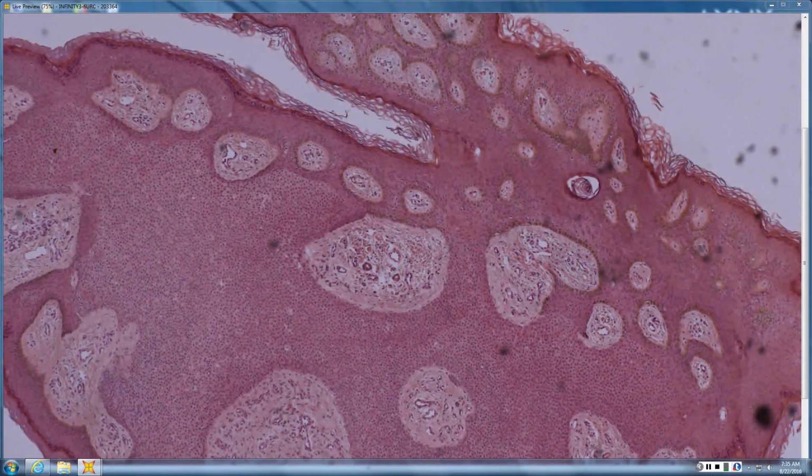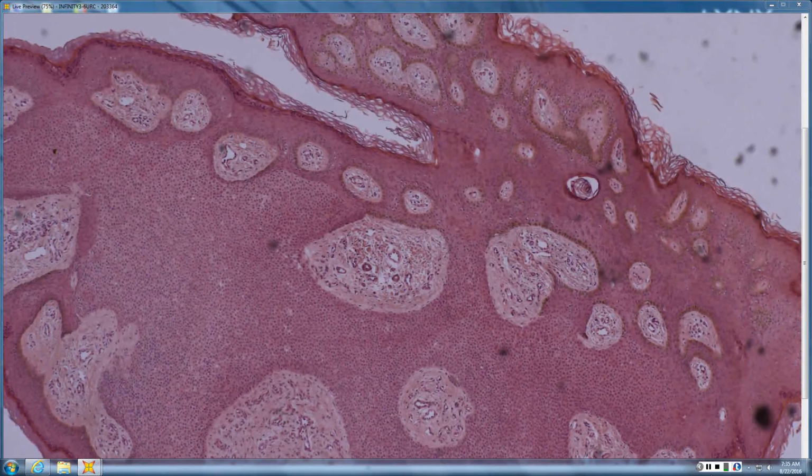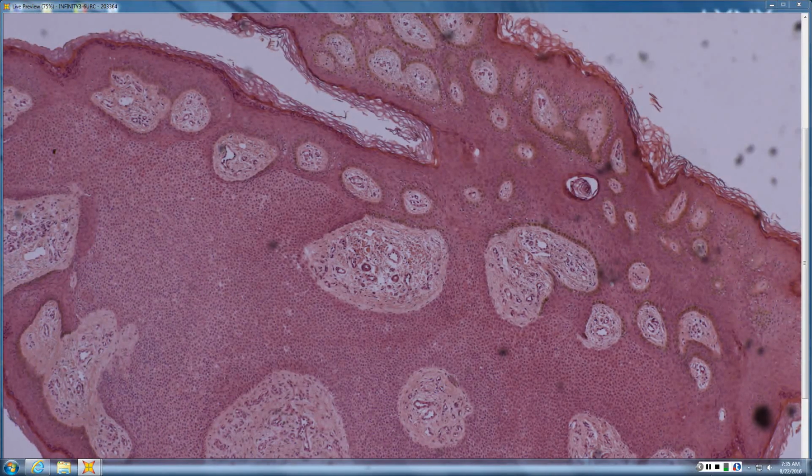The cells of an acrospiroma have ample cytoplasm, so they are pink tumors, whereas a lot of the others are just nuclei only. The ones that differentiate towards secretory coil are blue tumors. So this is one of the red tumors because it has cytoplasm. An acrospiroma. The cells are the same size as the cells of a seborrheic keratosis, because these differentiate towards the eccrine duct, and seborrheic keratoses differentiate towards the cuff of cells immediately surrounding the eccrine duct. So they're very similar cell populations, closely related.